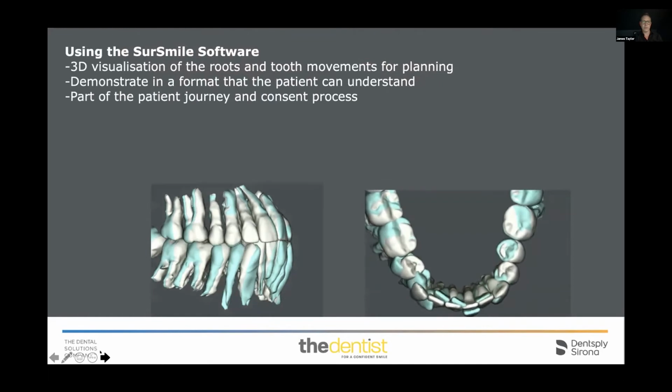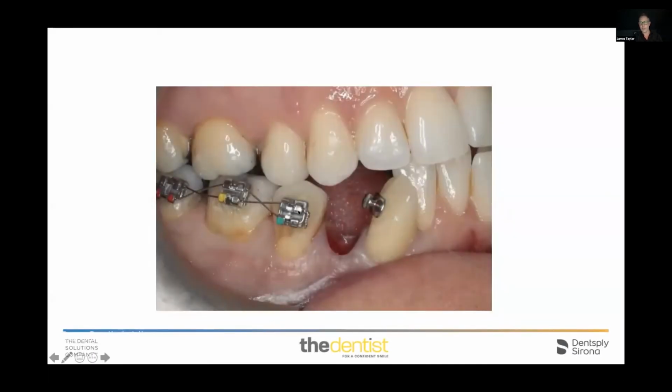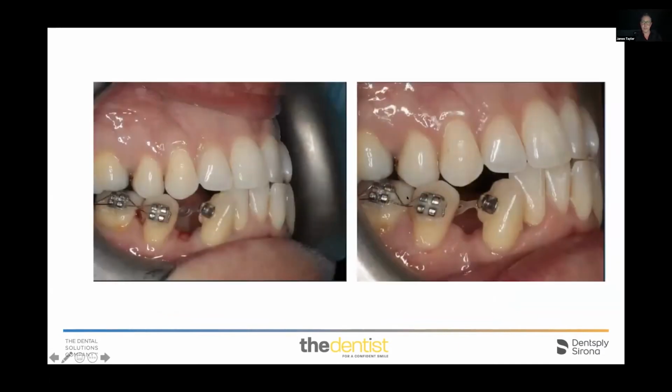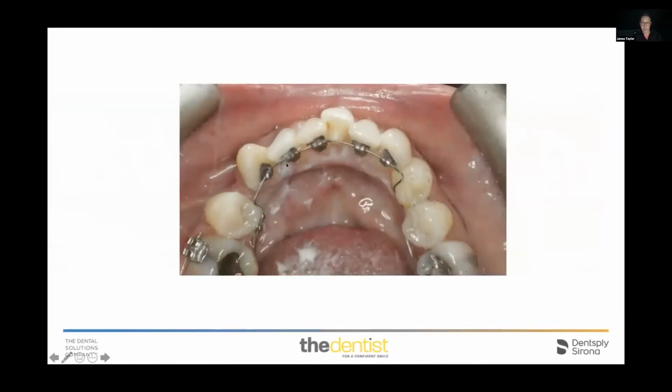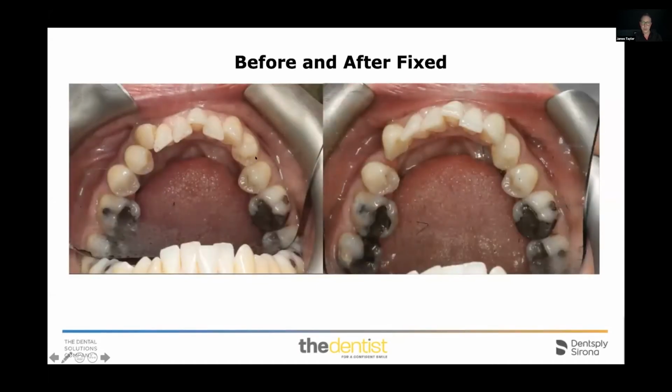And so essentially what we did, so I move to the next slide here, is we used a fixed on the bottom on the right hand side with a button on the 3, took out the tooth, and basically just retracted it with elastic power chain. And you can see how we're slowly moving that tooth into the correct position. And as it got further across, we then transferred it into a lingual appliance, because I do lingual as well. I put it into lingual to derotate that canine even further to allow me to at least get into a better position and have a good chance of achieving the final result with aligners. I'm now at the position where the tooth is in a much better position. The 3's here now, on the right hand slide. So I've moved it from far mesial here all the way back, which is great.